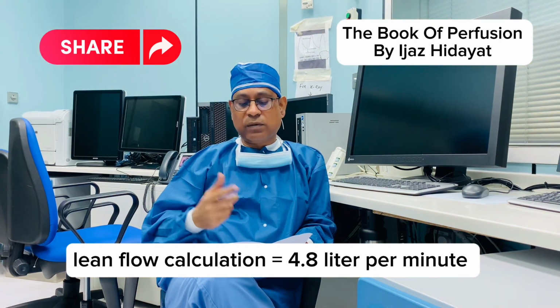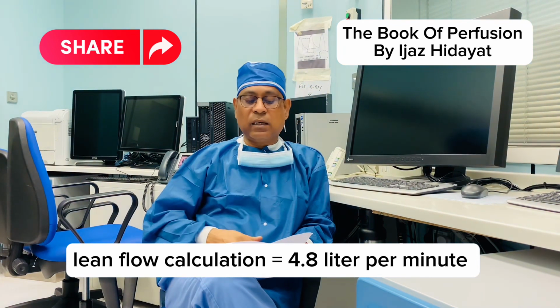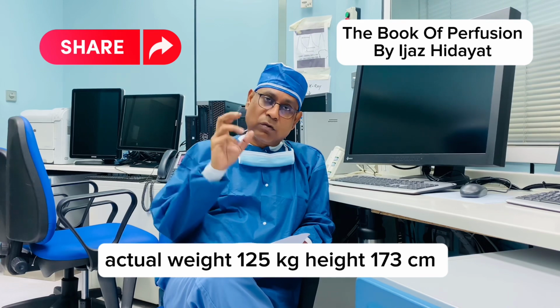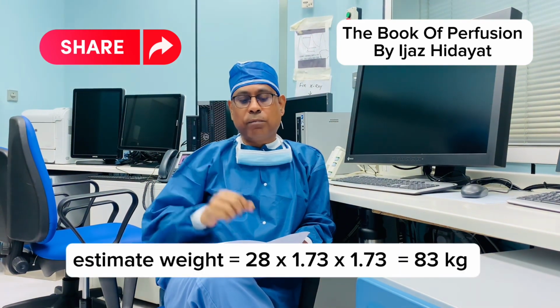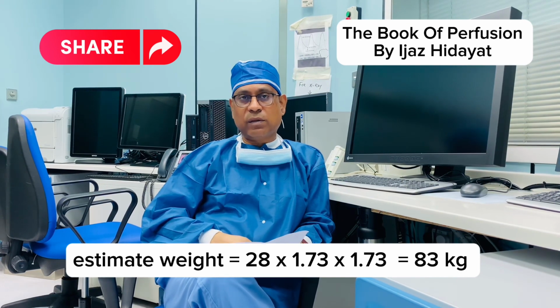The formula for calculating the estimated weight uses a constant of 28 kilograms per meter square times 1.73 meters squared.